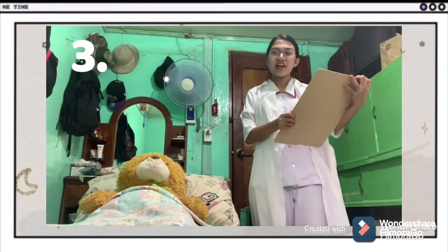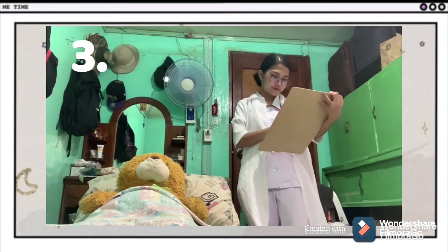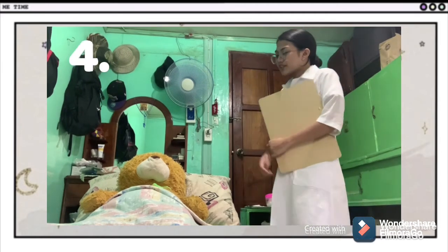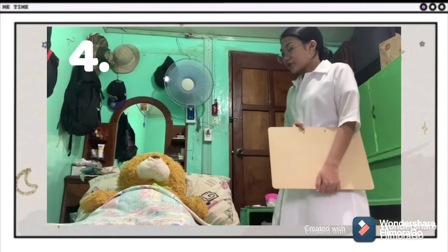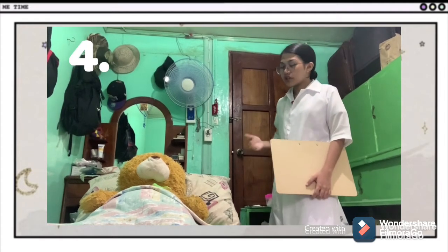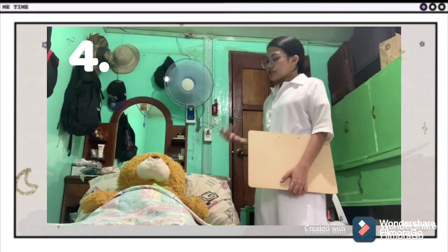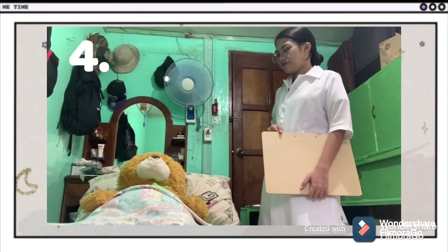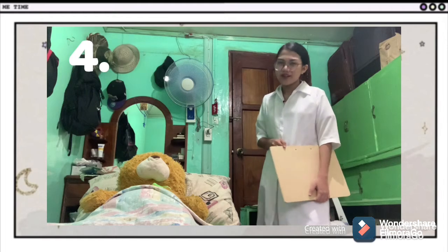Assess the need of client for catheterization. Explain the procedure to the client to elicit cooperation. Catheter sa imo ma'am para ma-eliminate ang urine sa imong body. Since maglisod man kag-urinate ma'am, di ba ma'am? So, okay ra ba na siya ma'am? Sige ma'am, thank you kayo ma'am.